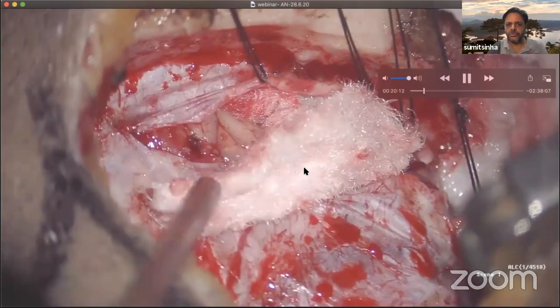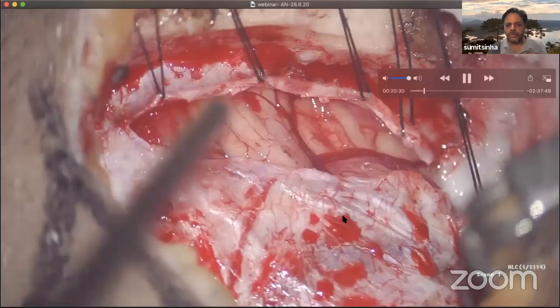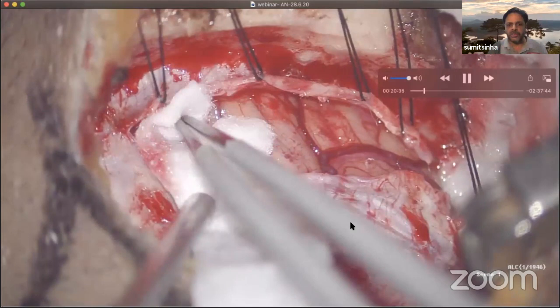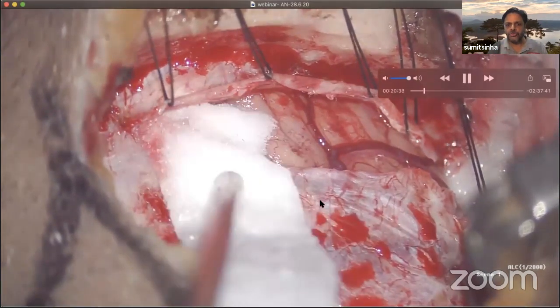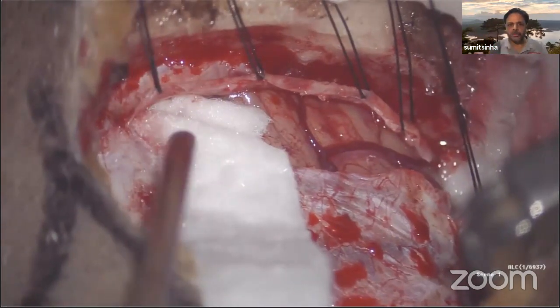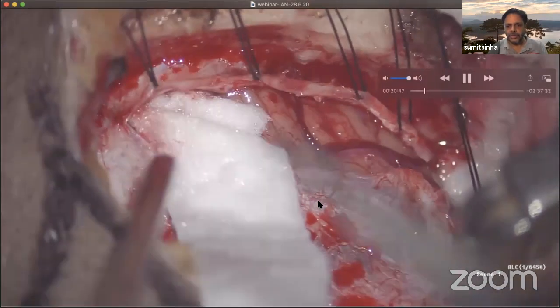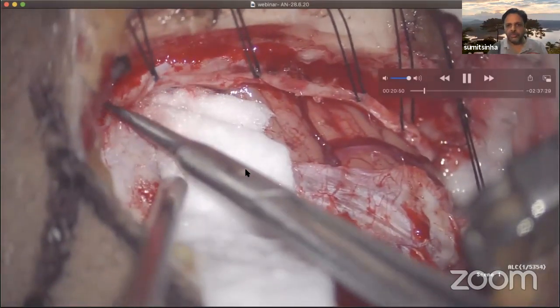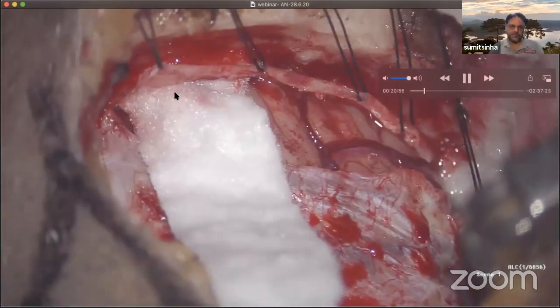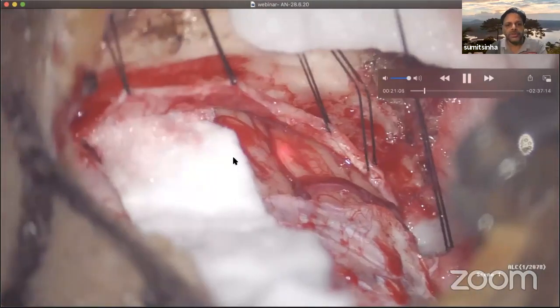And you take the stay sutures on the dural flap, the lateral dural flap. The medial dural flap, I prefer to keep as such over the cerebellar tissue. The reason is that this is a natural protection to the cerebellar tissue during my entire surgery. It does not allow the heat of the microscope to go into the cerebellum and damage it. So this is a natural protection to my cerebellar tissue. So the opening of the dural flap is complete. The second part of the surgery is complete.